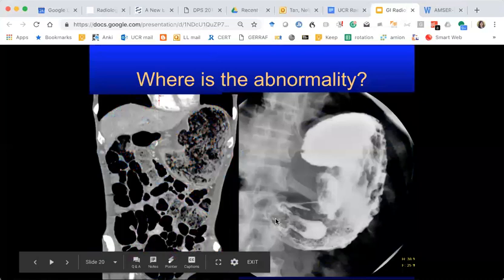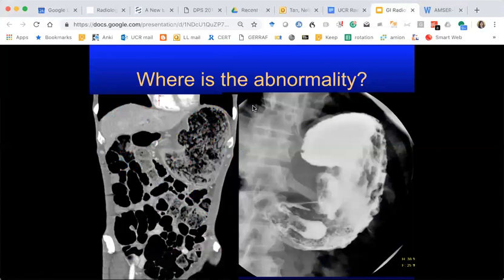Where is the abnormality here? This is a coronal CT, and this is an upper GI fluoroscopy study to evaluate the esophagus and stomach. We don't see this condition very much anymore. The abnormality is in the stomach — along the greater curvature.